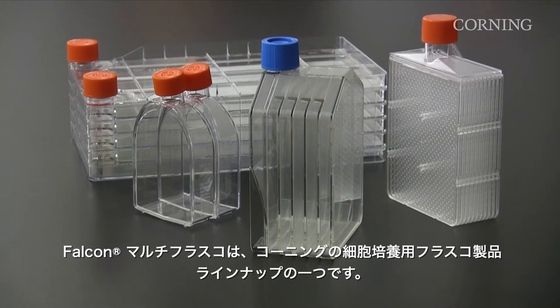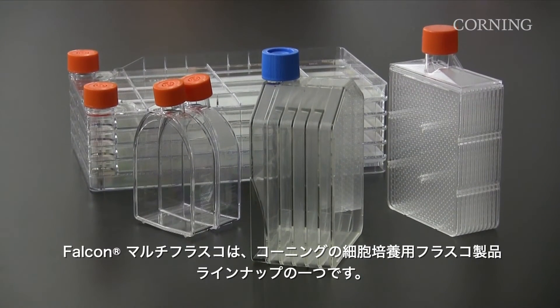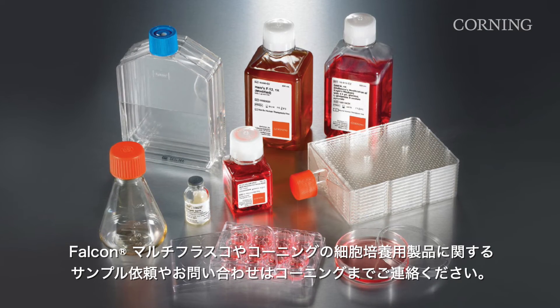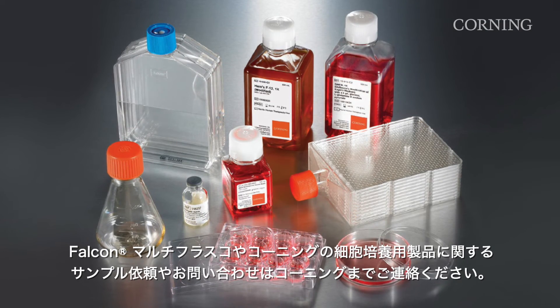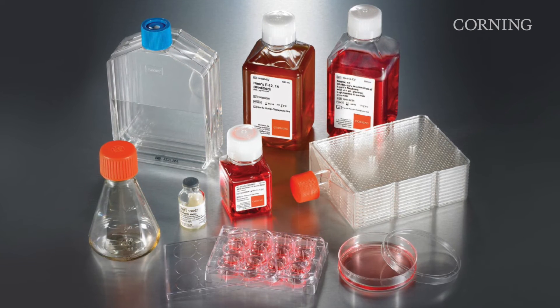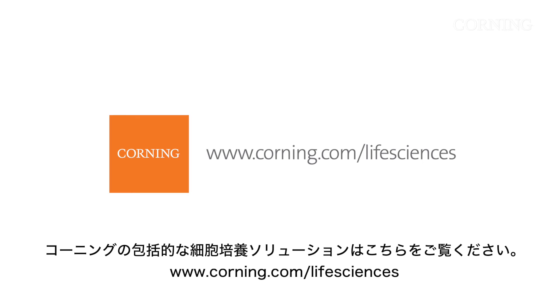The Falcon Multiflask is part of the Corning family of cell culture flasks. To order a sample or request a demonstration on the Falcon Multiflask or any Corning cell culture product, please contact your local sales representative. Visit www.corning.com/lifesciences to see our comprehensive, beginning-to-end cell culture solutions.